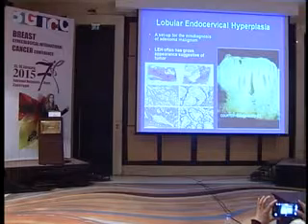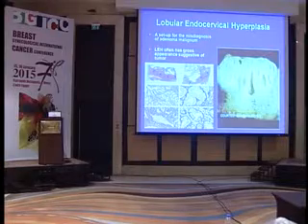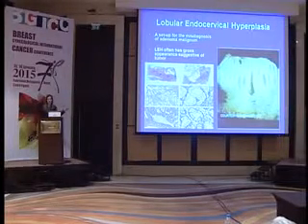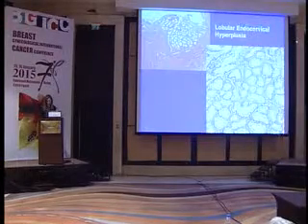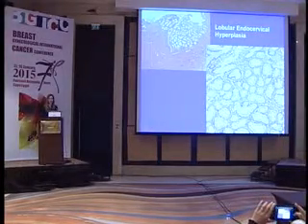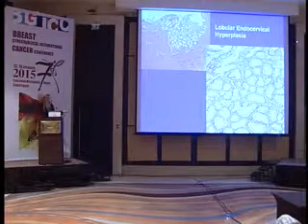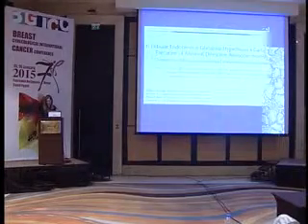So Ki67 will be very helpful. And the differential diagnosis, believe it or not, is lobular endocervical hyperplasia. This is completely benign, but sometimes when it goes deep, and sometimes you see some atypia, look at how deep it goes. This is the differential diagnosis. So you don't want to overcall this or undercall the malignant. Tunnel clusters, as simple as they are, are in the differential diagnosis, because sometimes they get so deep, but it's the lobular architecture of it. There is no invasion, there are no single glands everywhere, but it's in the differential diagnosis.